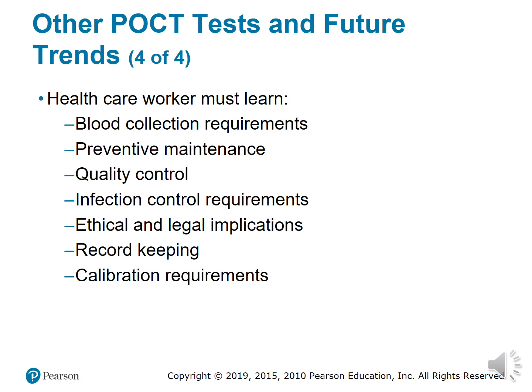They must always remember to do preventative maintenance because we don't want to transfer any infections from one patient to another. Make sure you give good quality control, meaning always test your instruments to make sure they're up to par, especially when you change out your battery or you clean it, or you just might think it's not running. You're getting too many error messages.